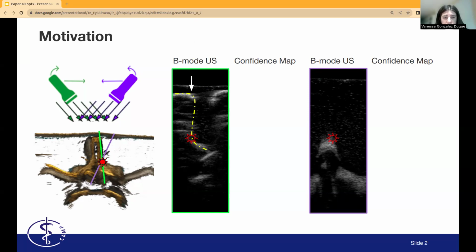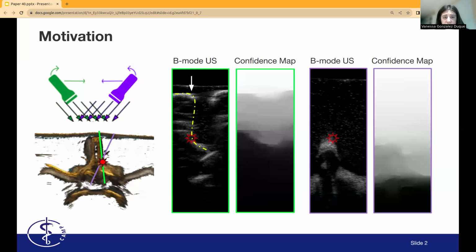One of the popular methods to estimate the uncertainty of the accuracy in given pixels is the confidence map. Due to the physics, more accurate values are closer to the ultrasound probe at the top, but with attenuation, scattering, and reflections, the signal gets lost and uncertainty gets bigger. In general, higher certainty values are represented with 1 and less accuracy with 0.